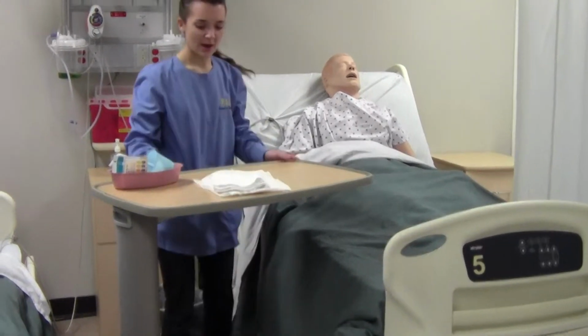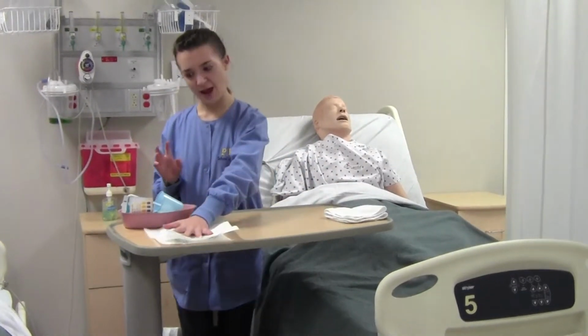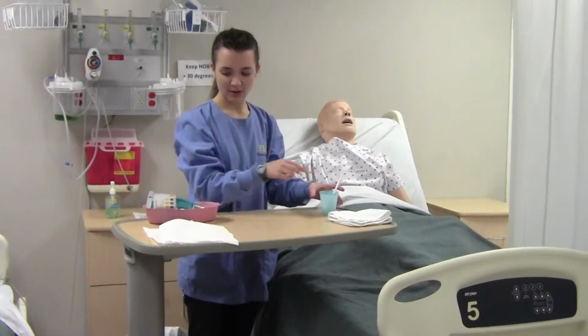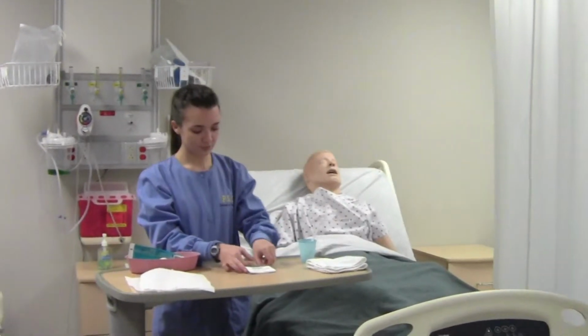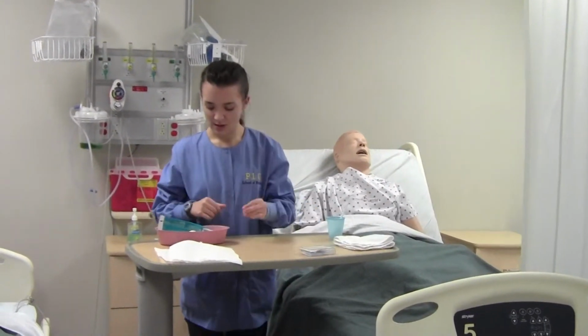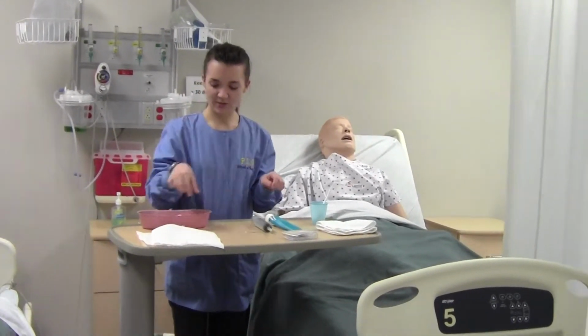Okay, perfect. So I have our washcloth here. I have this in its sterile package over here. We have your glass of water with your straw right here. We have our little pH paper. I'm going to pull one out. We're going to put that on the top. We have our lube, we have our syringe, we have our pin, and we have our tape.